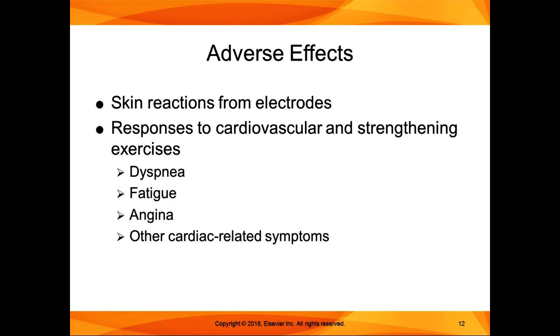Potential adverse effects are skin reactions to the electrodes, and if you're doing something that is causing a cardiovascular or strengthening exercise, you can have cardiac-related symptoms, dyspnea, fatigue, angina, or other cardiac-related symptoms. That is not really an effect of the biofeedback device itself, but of the cardiovascular and strengthening effects you are causing the patient to engage in when you're using it.